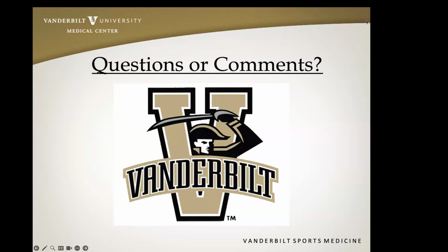And then I think the last two things I want to comment on. One is soleus ultrasound. Ultrasound of the soleus muscle is not very sensitive, so we can certainly miss injuries in that area. Especially in our athletes, we think about the gastroc being a prime mover for explosive movements, but it's actually still the soleus, even though we think about the gastroc being the quick twitch muscle.